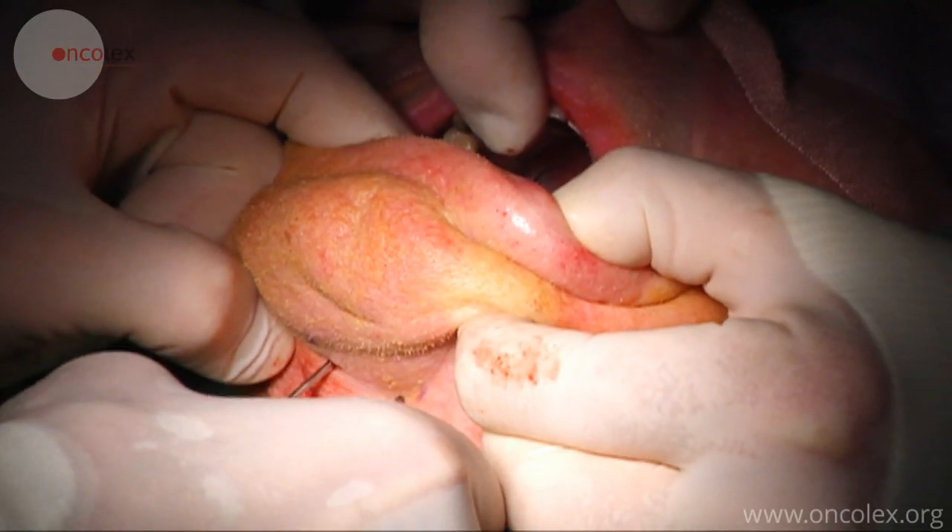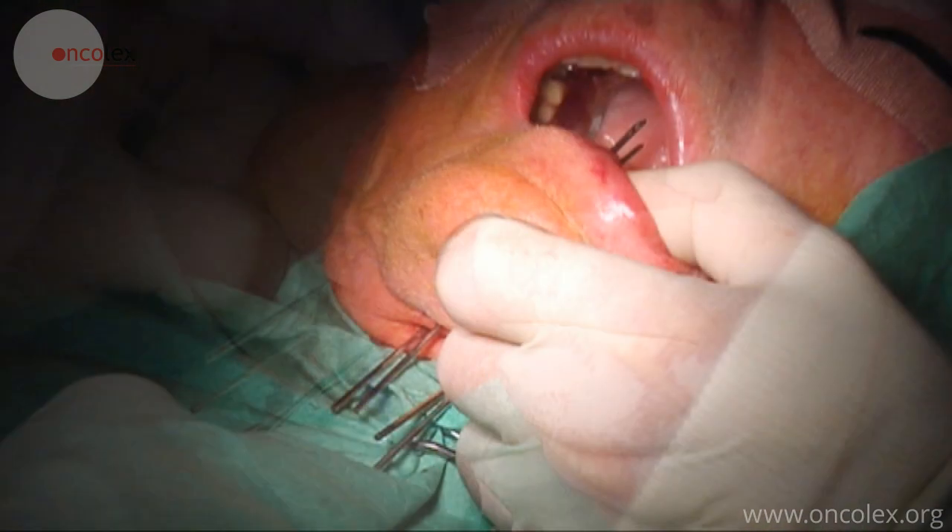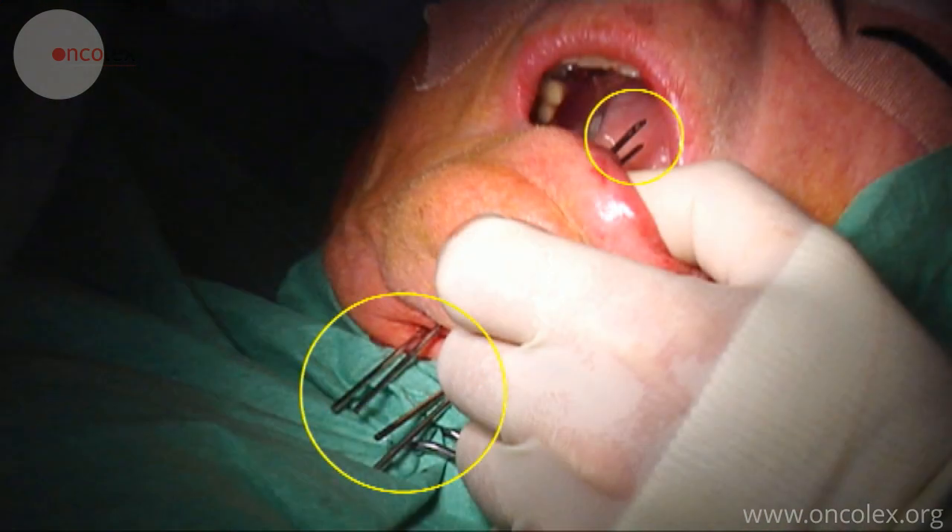The needles are placed parallelly to create a quadrant around the target area. Here we see the needles placed through the tongue.